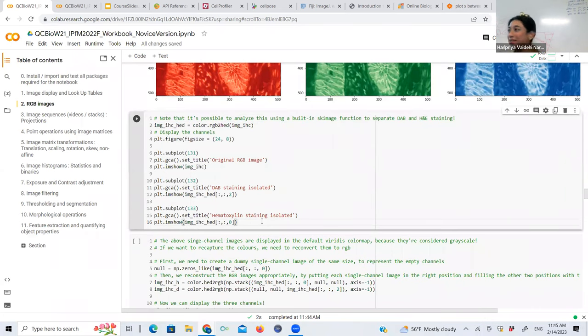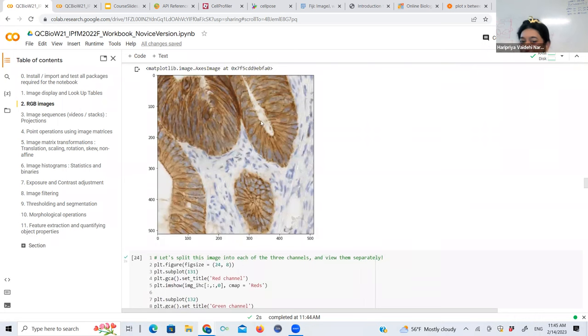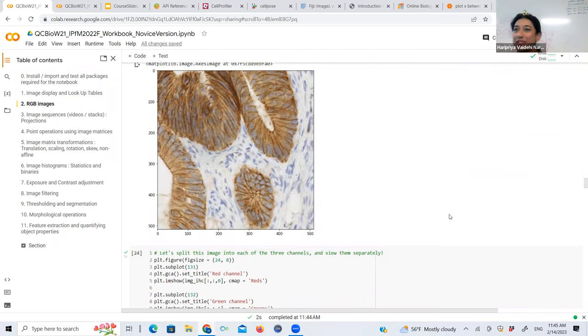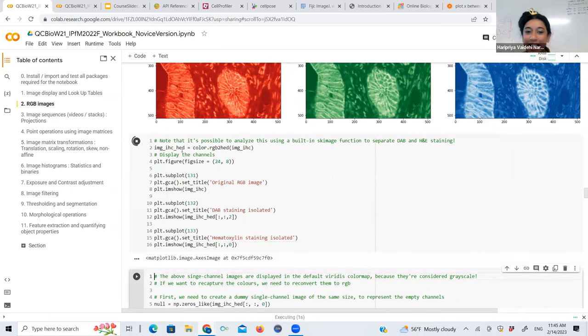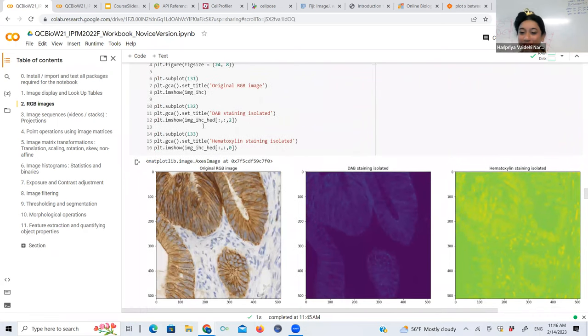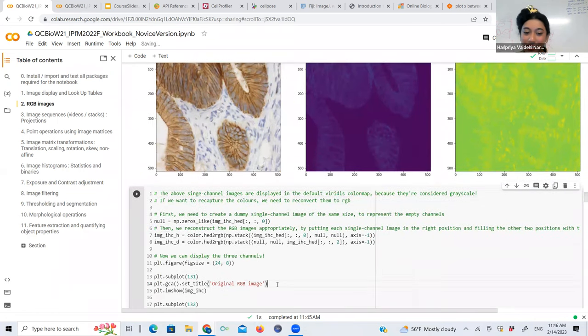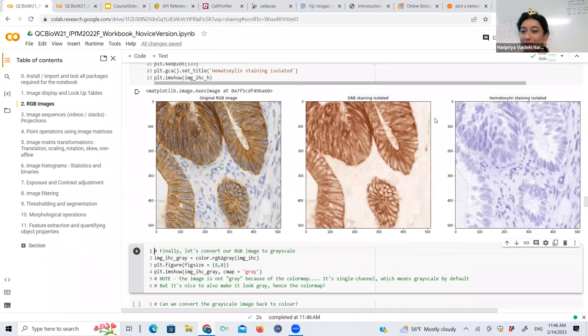So these are standard pathology images. And so there's actually a built-in function in scikit-image, if you want to separate this very nice brown staining here from these blue nuclei and stuff. I'm not going to get into the details of this. I've essentially given you the code for it. But there is this thing, HED, hematoxylin, eosin, and DAB staining for pathology, and you can split it. If you display it in RGB, it still doesn't make sense. So you're supposed to do one more step, which you can look at later. All of this is built in, but the bottom line is that you can split these two channels.